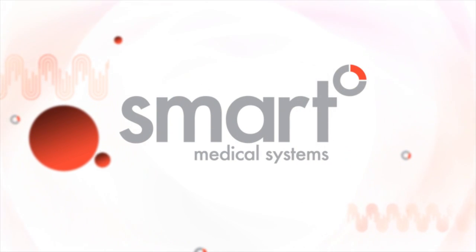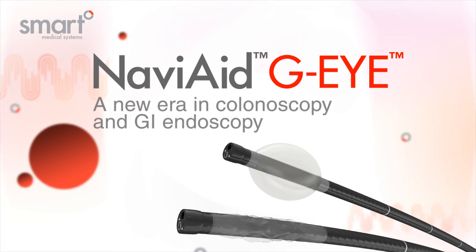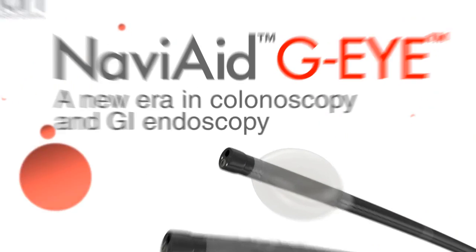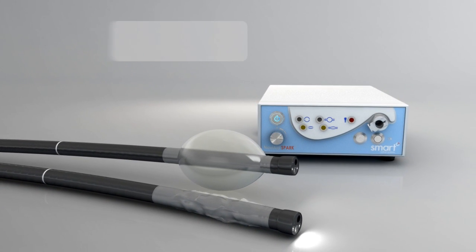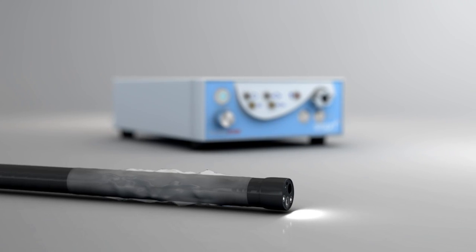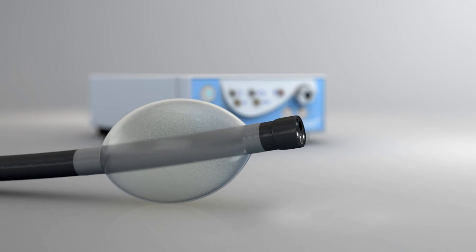Smart Medical Systems introduces the NaviAid G-EYE Balloon Endoscope, a new era in colonoscopy and GI endoscopy. The G-EYE endoscope employs a unique balloon technology for increasing colonoscopy diagnostic yield. It relies on a standard endoscope having a permanently integrated, reusable balloon at its bending section.